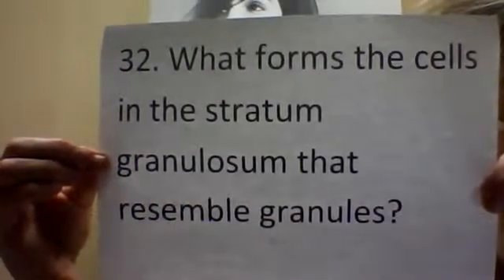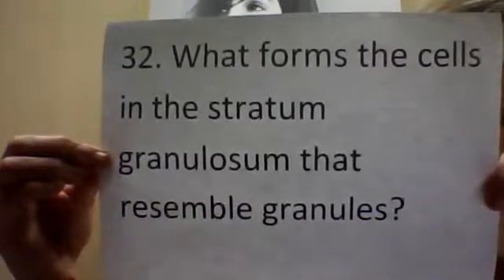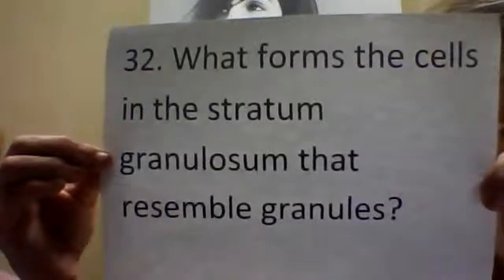So what are those little cells in that stratum granulosum that show like a granule? Is it collagen? Is it keratin? Elastin, or melanin? Remember we talked about the granulosum layer being a little more plump, and then those other layers start to get really thin toward the top. So this is kind of plump, so you can see these granules in there, and it's keratin. It's keratin granules in the granulosum. It's that protein that's forming, and it's living right in there, and it's dying off as it gets into corneocytes, hardened keratin.